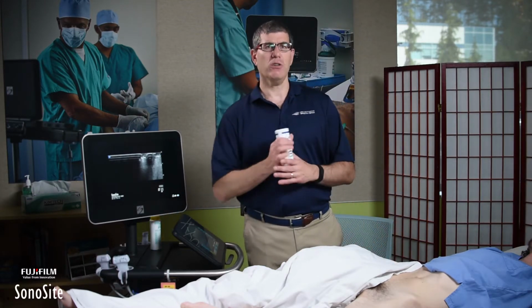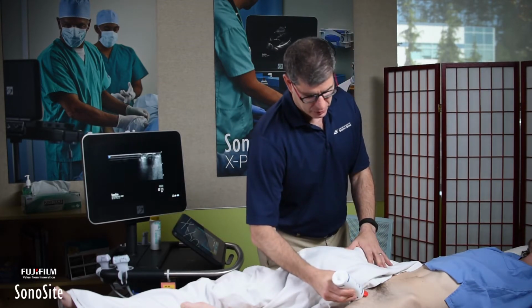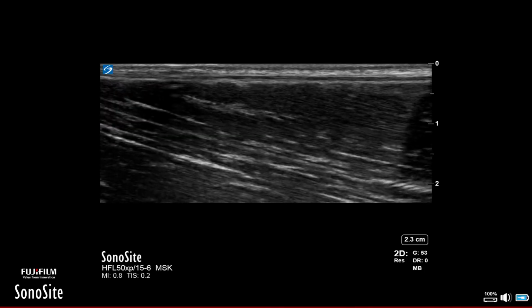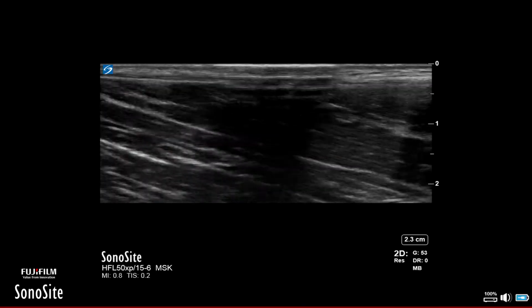We're going to take some gel, make sure to warm it to the extent that you can, or at least let the patient know that it may be cold, and then we're going to be applying that along the inner thigh. I'm going to be using a linear probe, and what we're looking at is the adductor musculature as we advance towards the pubic bone.